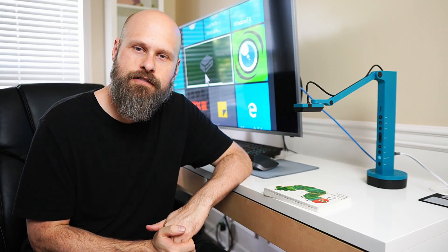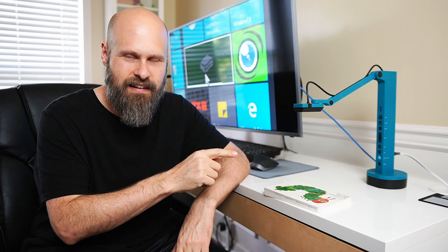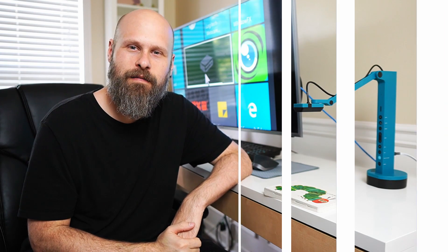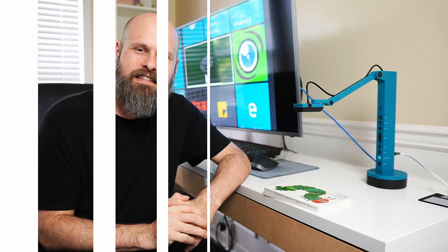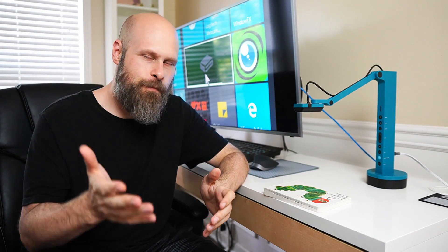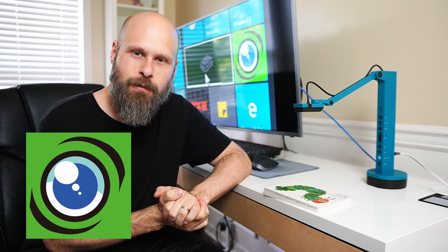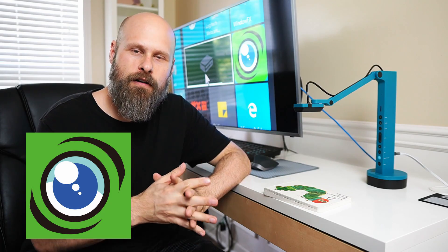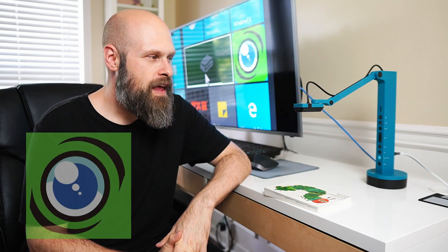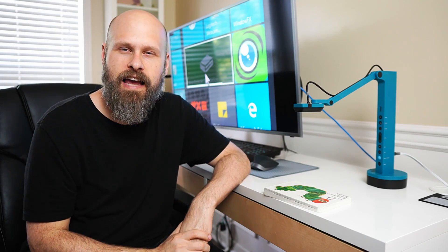Today we're going to look at the visualizer software that goes with the iPIVO VZX document scanning camera. Hey guys, it's Sam with The Blind Life. So many of you wanted to see it, so today we're taking a look at the visualizer software. This is free software brought to us by iPIVO and it can be used with any of their document scanning cameras.